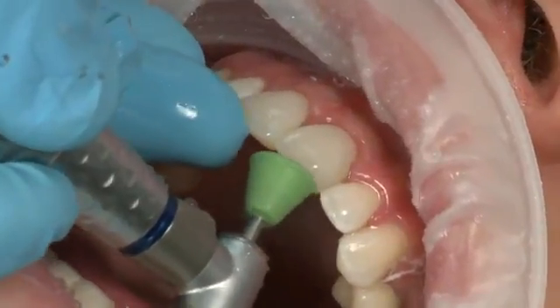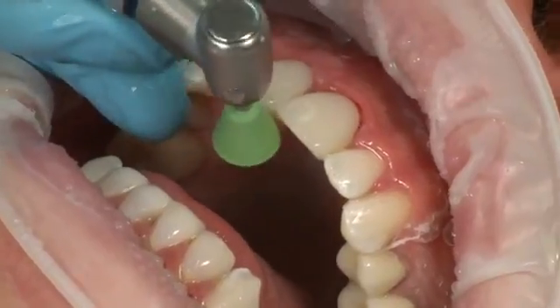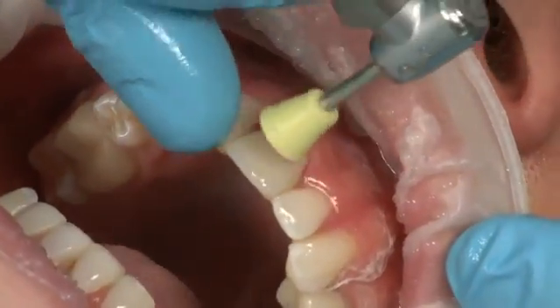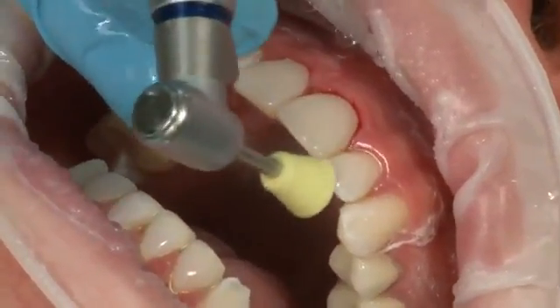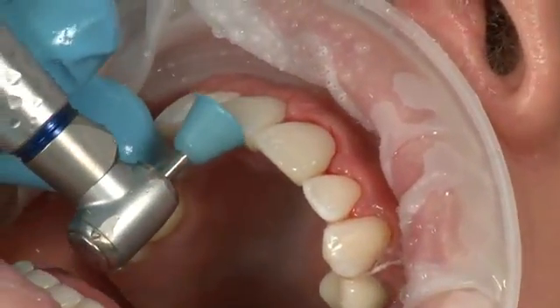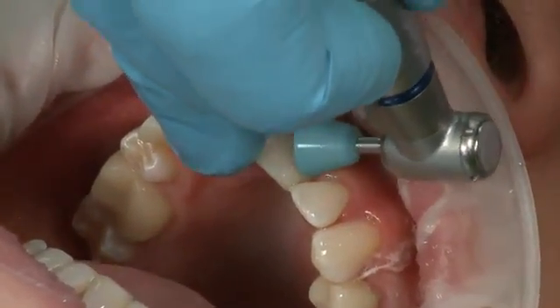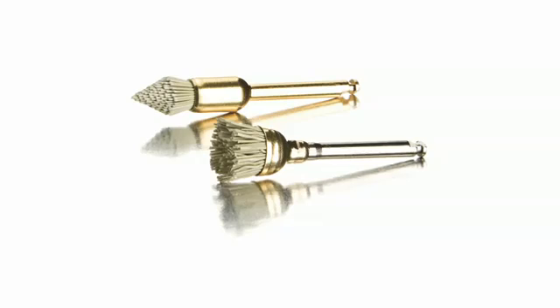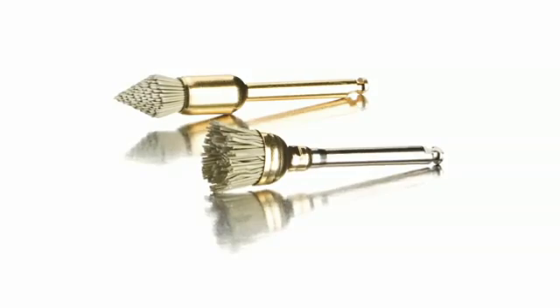Polish all margins and the incisal edge using the Jiffy polishing cups. Start with the coarse green cups, then use the yellow cups. Finish polishing the marginal areas with the blue HiShine finishing cups. Clinicians should use care when finishing to not remove the laser-sintered polished surface of the Edelweiss composite veneer. If the laser-sintered surface is disrupted during the finishing process, restore the polished surface with a Jiffy polishing brush.